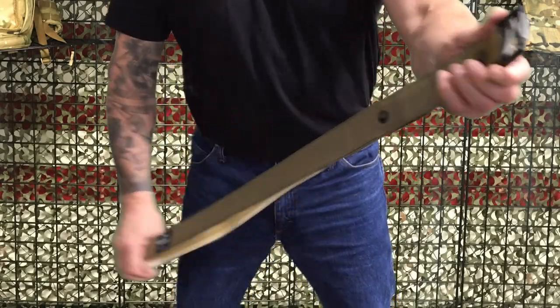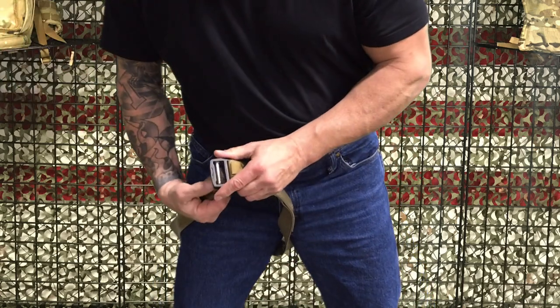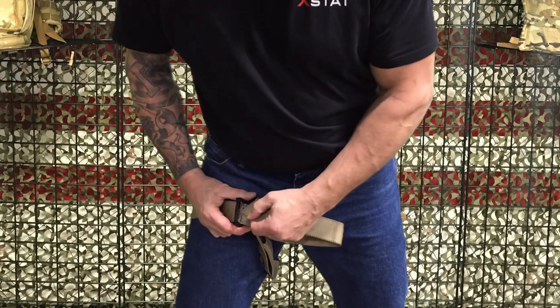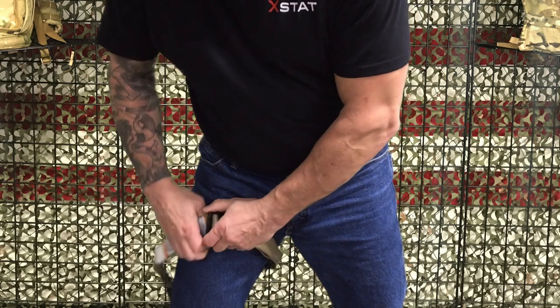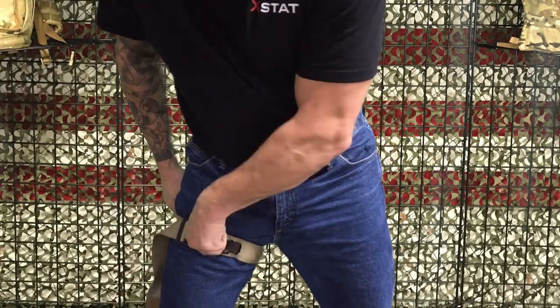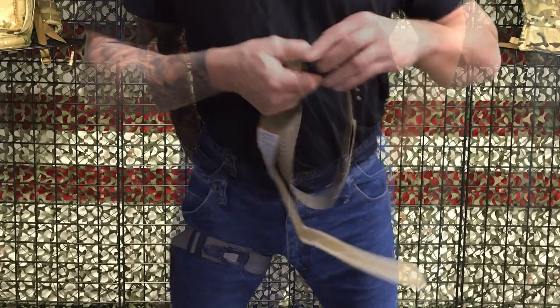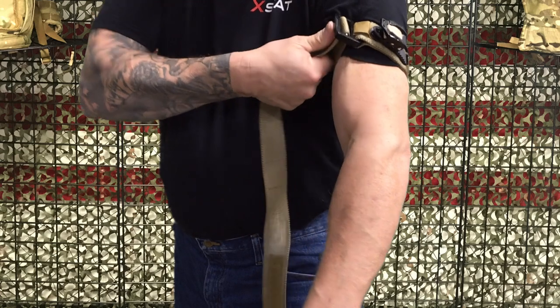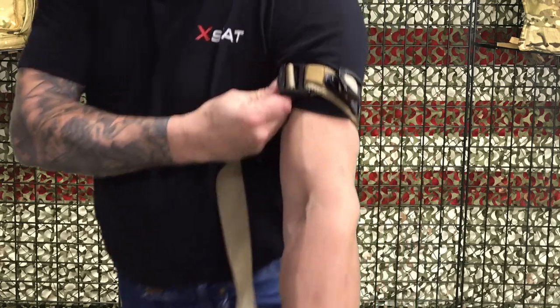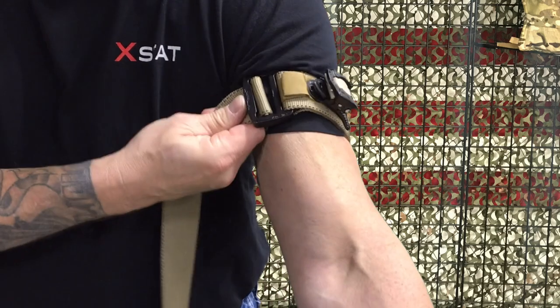To use the Parabelt, simply remove the belt and route it high and tight around the limb. Make sure to pull the webbing as tightly as possible before tightening the ratchet. This can be accomplished by grasping the sides of the buckle and pulling tight. When applying to your own arm, you can bite down on the thumb loop to tighten the webbing, or use your thumb levered against the buckle to assist pulling the webbing through the belt.